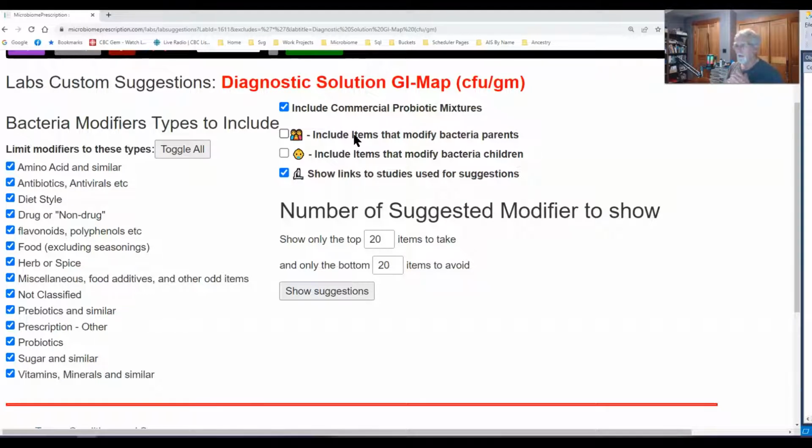What often happens is we have bacteria arranged in a hierarchy. Bottom level is strain, species, genus, family, order, class, phylum, etc. These correspond in terms of a human population, so of a gut bacteria population, as for example, a neighborhood, a county, a state, a country, a continent, and so we have the same hierarchy.